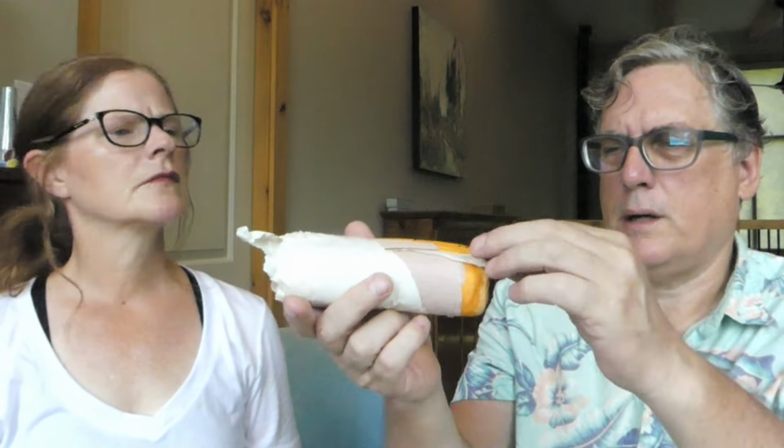Okay, so this has got paper on it, and it's kind of like a little origami package. Okay, so the paper's falling apart. And it looks like, I don't know if it's discolored or that's the color that the dressing is supposed to be. We're not convinced that this isn't discoloured. I think this is actually the colour it's supposed to be. Orange? Yeah. Now you should be able to open this in a way that doesn't contaminate it.